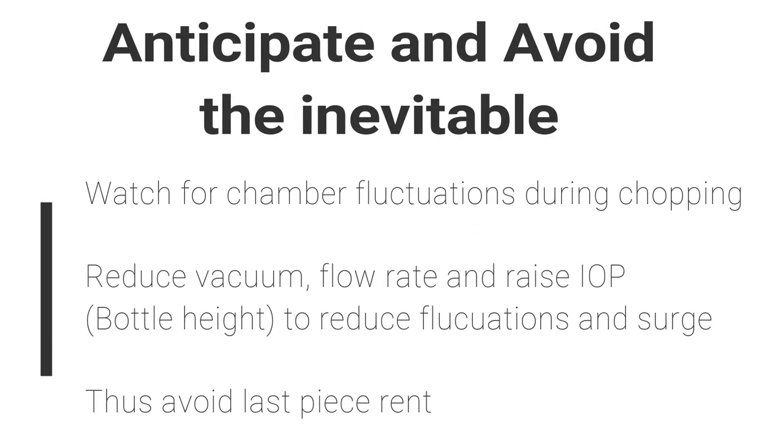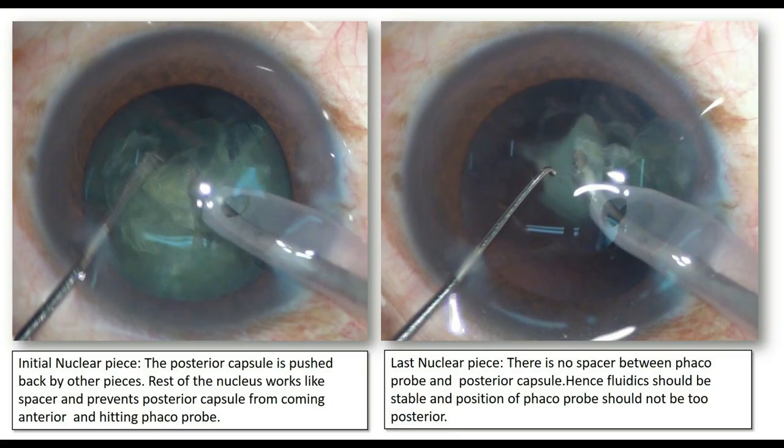Watch the chamber fluctuation during chopping, reduce the vacuum and flow rate, and raise IOP to reduce fluctuations and surge — and thus we can avoid posterior capsular rupture. When you are chopping the initial nucleus pieces, the posterior capsule is pushed back by the other pieces, so the rest of the nucleus works like a spacer and prevents the posterior capsule from coming anteriorly and hitting the FACO probe.